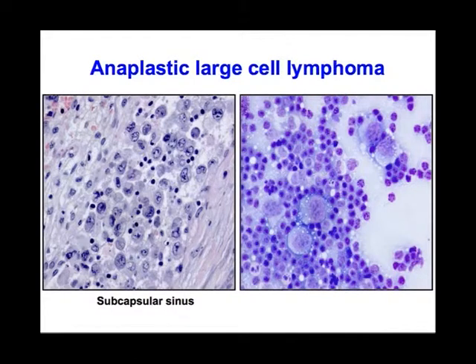So here we have a characteristic case here in the subcapsular sinus. I have no doubts that 20, 25, 30 years ago, these cases were coming through our clinics and were not being recognized. They had cohesive-looking infiltrates in subcapsular sinus, big ugly cells. This is before immunohistochemistry. These things were called primary unknowns, metastatic neoplasms, epithelial probably. I have no doubts that that was happening. But once the reagents came along to recognize these, we now are much more attuned to them.